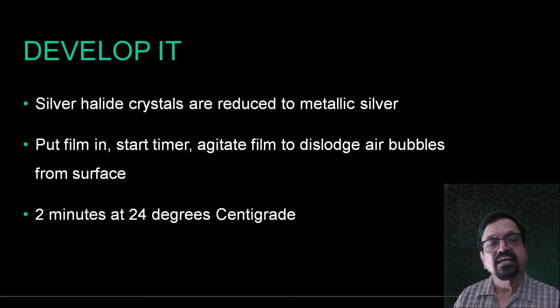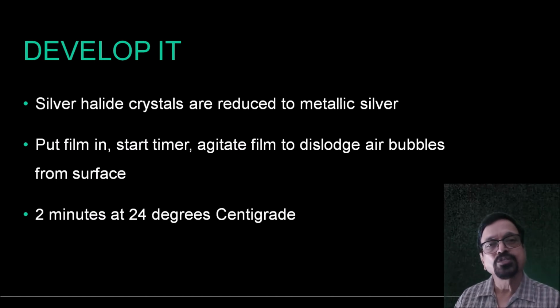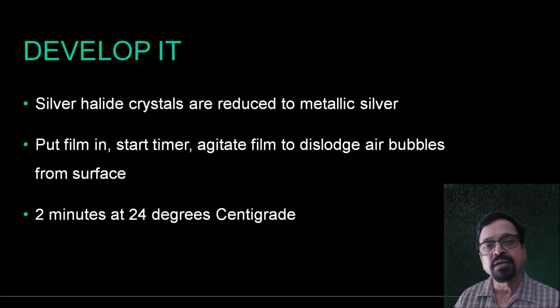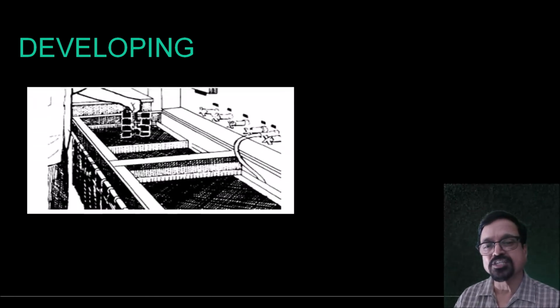And third, the time required for developing and fixing depends on the temperature, how old your developer is, and how many films you are developing per day. In the morning, if you have a big workload, by evening your developing time will go high. The temperature chart needs to be maintained in whichever way possible, but in most departments where we work, we do not have these temperature charts.